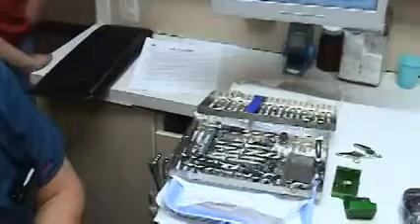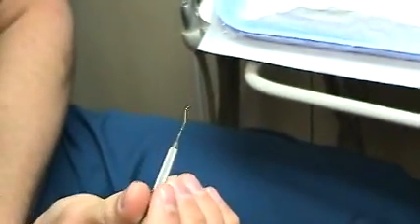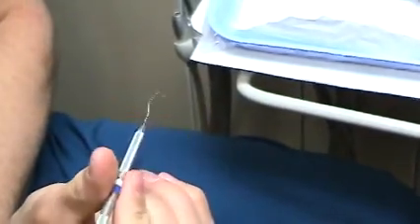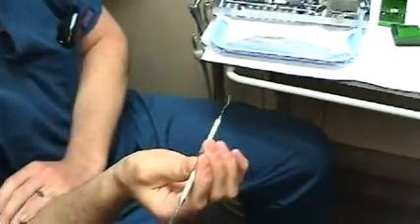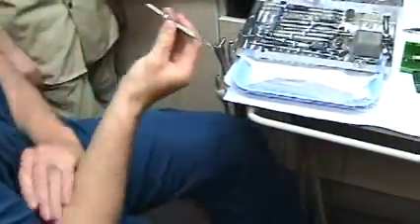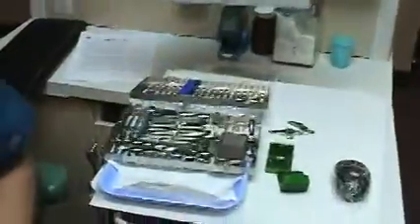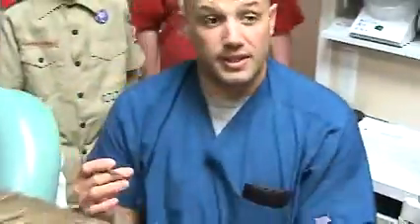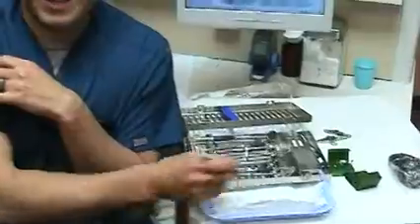All right, so what we have here, when you guys go into the dentist, do you ever feel him poking at you and feel that metal thing running across your teeth? That's what this is, and we call this an explorer. Everybody see that? It explores the mouth. Real sharp ended. The reason that it's sharp is because when I am going over your teeth, remember that your enamel's very hard. And so most of the time it's going to just slide across it just like glass.